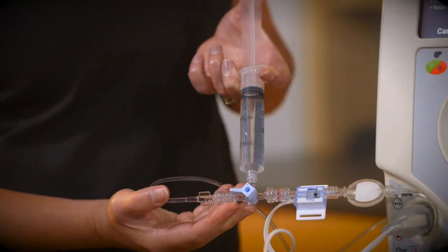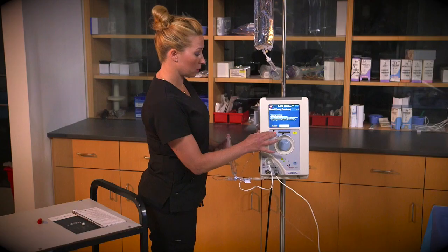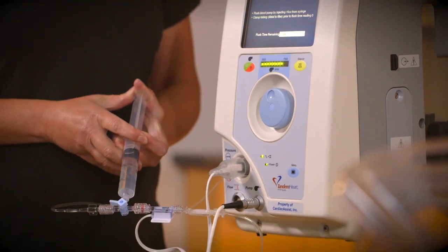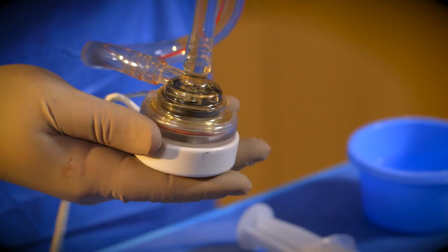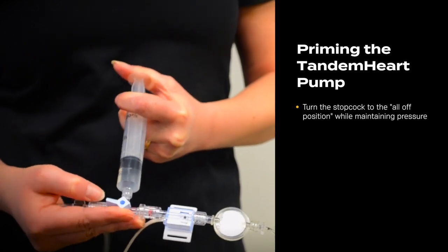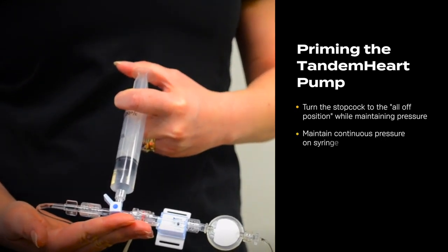The controller operator turns off the stopcock to the bag and injects the heparinized saline. The controller operator then presses the pump Start-Stop button and continues to inject heparinized saline from the syringe. The pump will automatically run at a speed of 7,000 RPMs for 10 seconds. The controller operator then turns the stopcock to 45 degrees in the all-off position while holding pressure on the syringe. The controller operator must maintain continuous pressure on the syringe throughout the pump priming process to ensure that air is evacuated. The controller operator then inspects the lower housing of the pump for air bubbles.